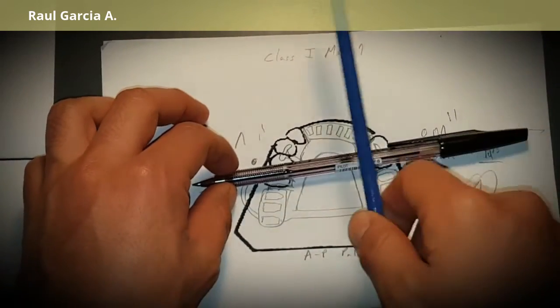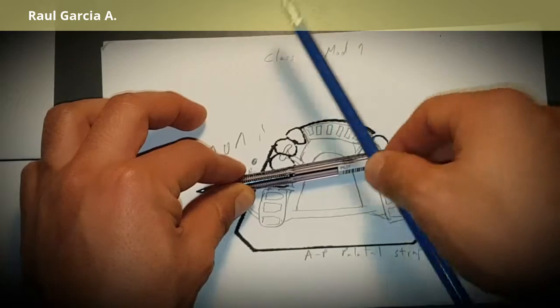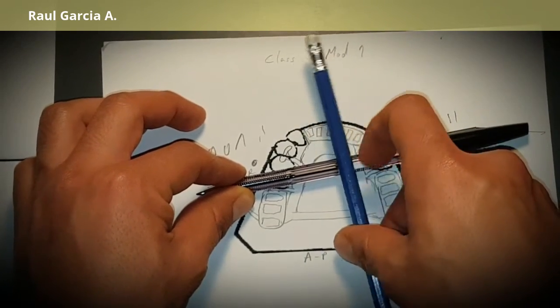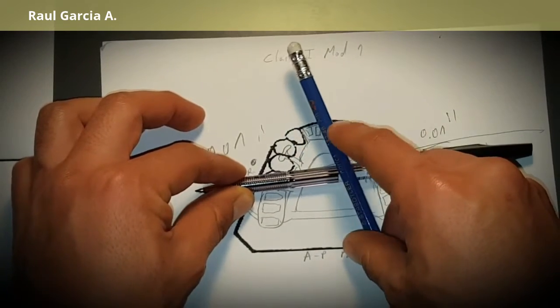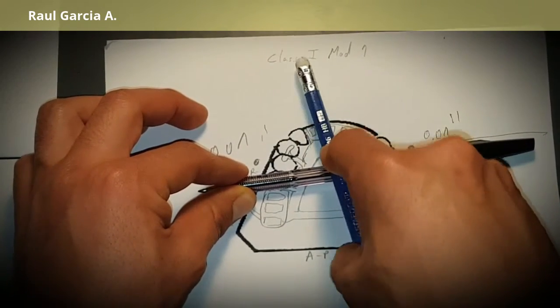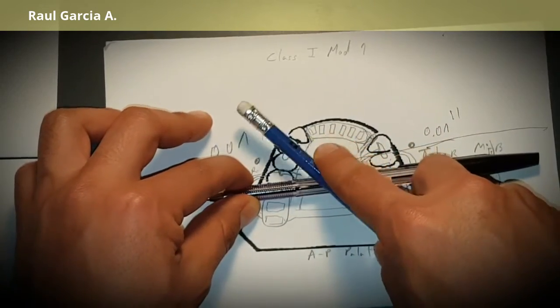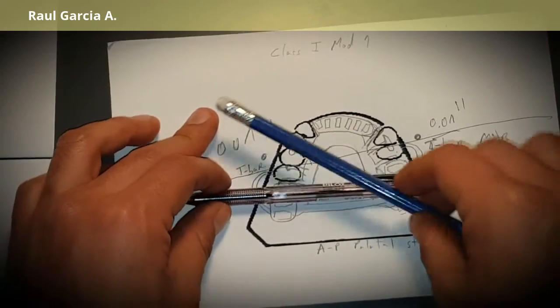The indirect retainer must be at 90 degrees from the fulcrum line position. We analyze whether the tooth at that 90-degree position is suitable. In this case it would be near the anterior teeth, but we cannot use those for indirect retention support. Always choose indirect retention from the canine and behind.